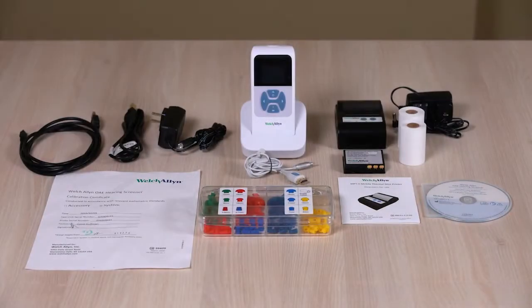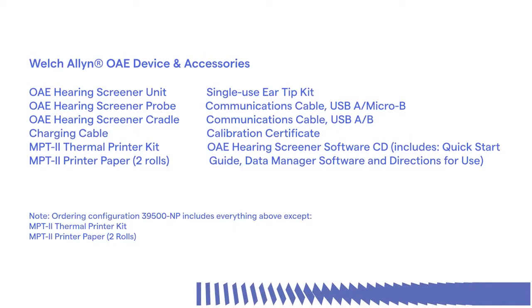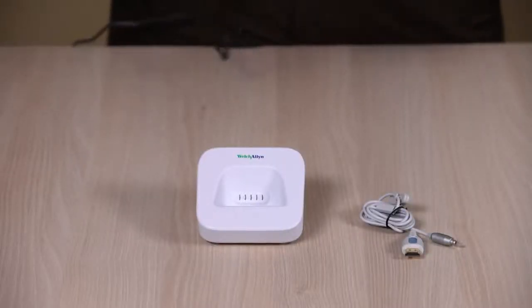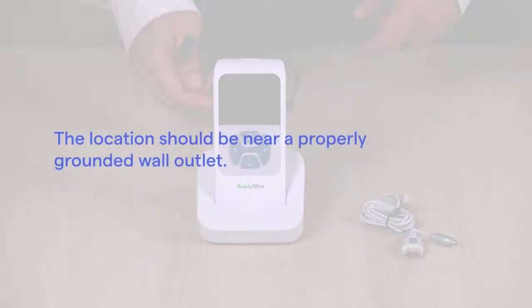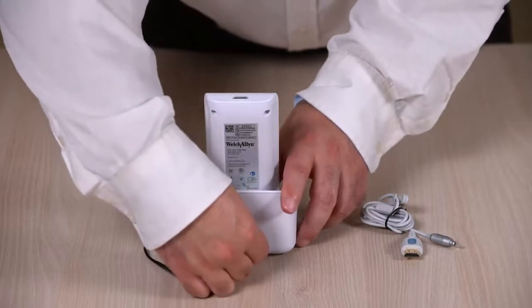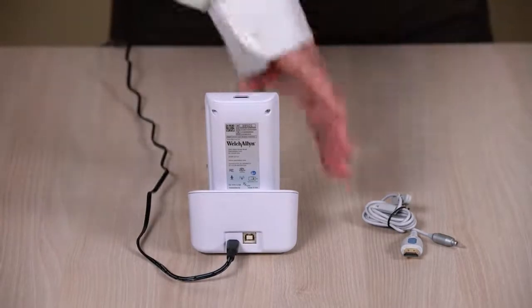Here's what is included with configuration number 39500, the OAE hearing screener system. To set up the device, place it on a stable counter or table where it will be used, in a quiet testing environment. The location should be near a properly grounded wall outlet. Place it on the cradle, connecting the micro USB to the back of the cradle, and plugging the wall charger into an AC outlet.